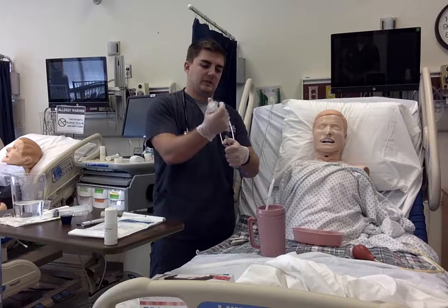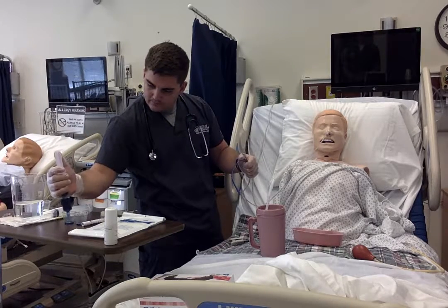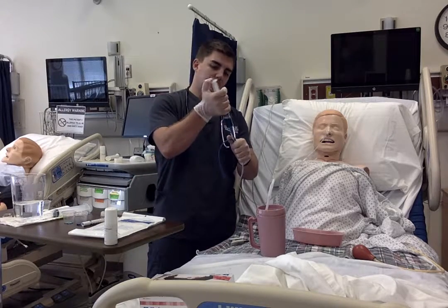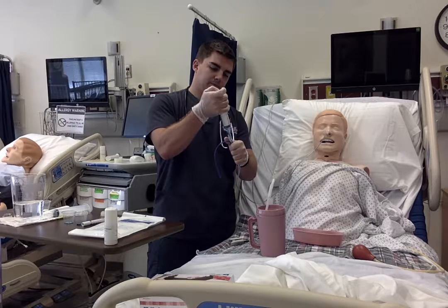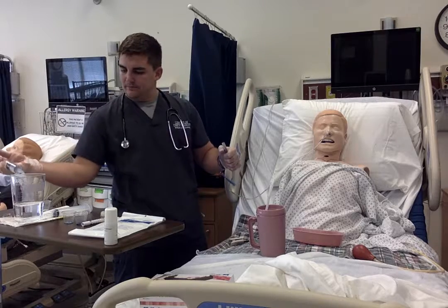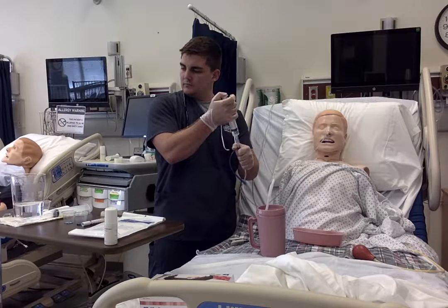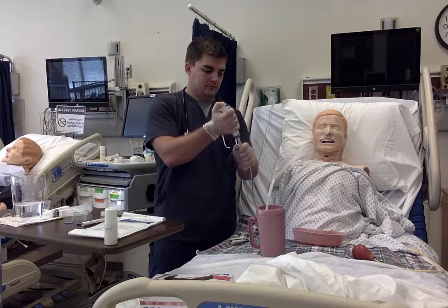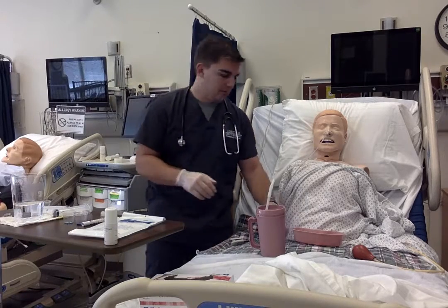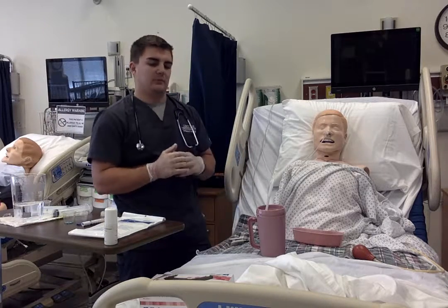Since I just flushed it, I would get my second medication. Instilling it, and then flushing it again with 20 mils of water. So that is the administration of medication through an NG tube, and next would be removing the NG tube.